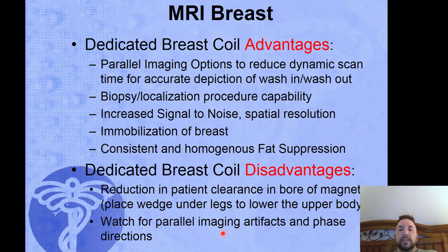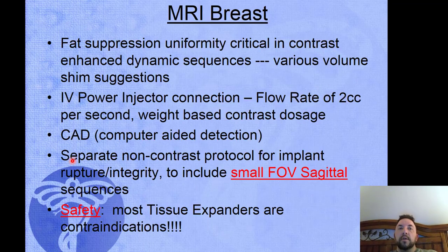As we increase our reduction factor, we get centrally located artifacts which identify them as being parallel imaging artifacts, as opposed to wraparound, which occurs at the outer edges and works its way in. Parallel imaging starts in the middle and works its way out. So just that you can differentiate artifacts and the source of where those artifacts do occur.